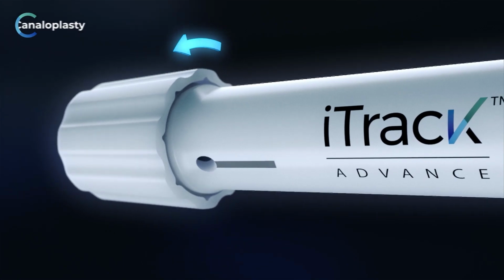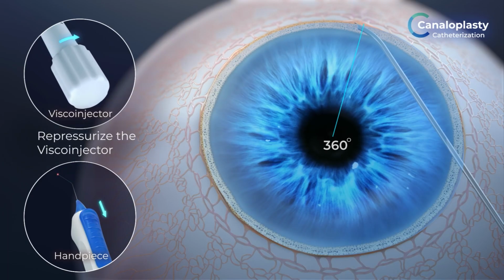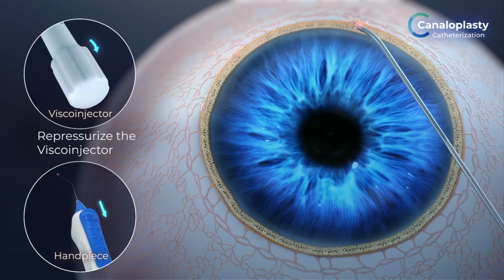I say 3 to 4 at least clicks or so of viscoelastic per clock hour. That's about 10 or 11 microliters of viscoelastic per every clock hour. At first I was a little bit more fearful of that, but now I feel comfortable doing that. I think that allows us to really flush the entire system out, create those herniations in the TM, and also help the episcleral venous system and help the collector channels open up as well.